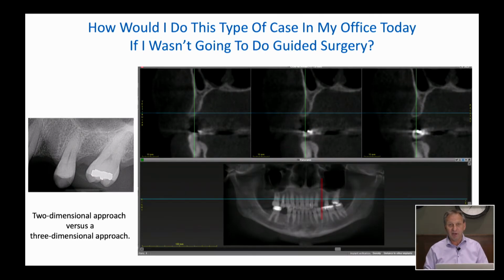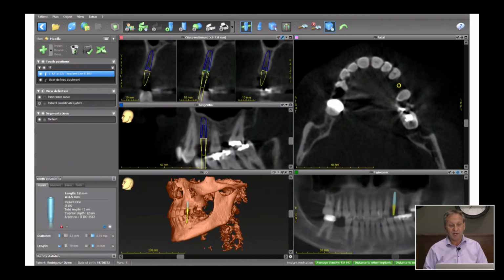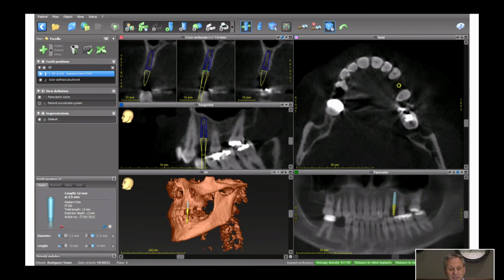Now, since I have a CT in my office, not everybody has one, but if you have one, even if you're going to do freehanded dentistry, there's a lot of data that you can get from the CT machine. You can't take that data to the surgical field other than what you can keep in your head. There is no device that you would use to move that data to the surgical field. But just having the three-dimensional x-ray before you do surgery gives you this information. So you can go in, even though you're not turning this into a surgical guide, pick your implant system of choice, place it in the bony structure, put on an abutment and a crown, and see if everything lines up the way it should. So this is kind of old news, but it's pretty effective news still in 2020.